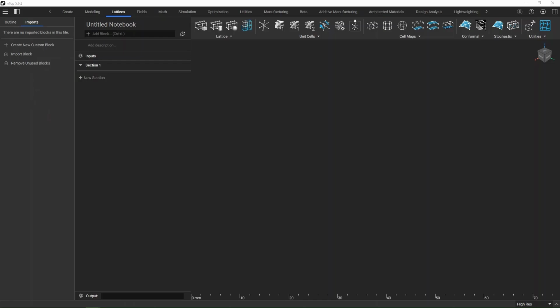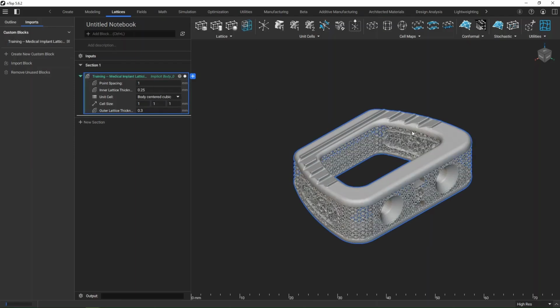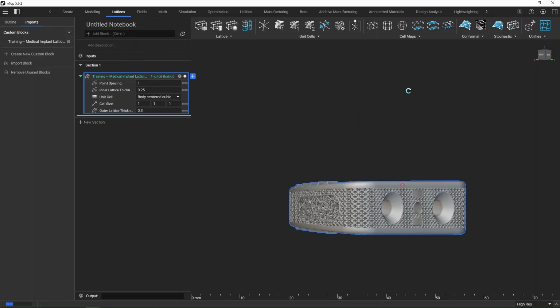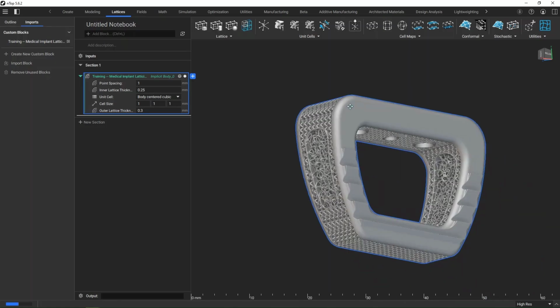Here it's opening up my directory. And I'm going to click on that same medical implant latticing block or nTop file that we just saved. So here you can see it's importing. And it's actually just running right away. So it's running with those exact same inputs that we had before. So this is what we've already seen.